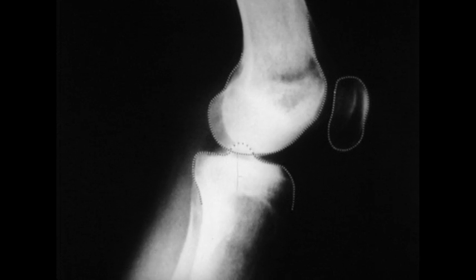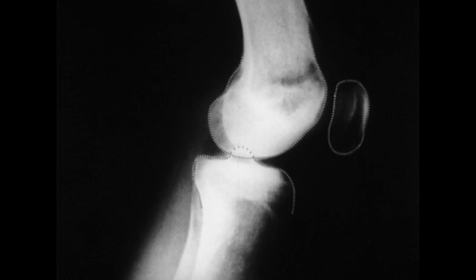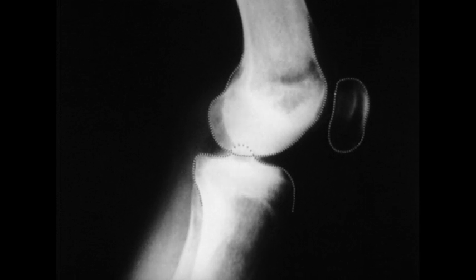The patella is an irregularly shaped sesamoid bone contained within the tendon of the quadriceps femoris. It lies outside the capsule of the knee. The patellofemoral articulation is between the patella and the condyles of the femur. With the knee extended, the patella is anterior to the condyles of the femur, superior to the axis of the joint. As the knee is flexed, the patella moves into the groove between the condyles of the femur, filling this groove and protecting the condyles.